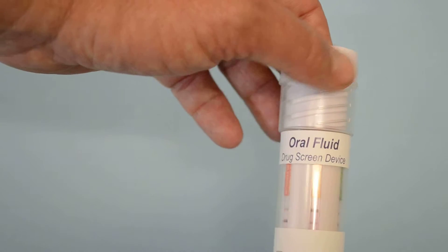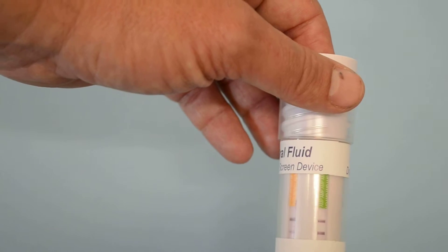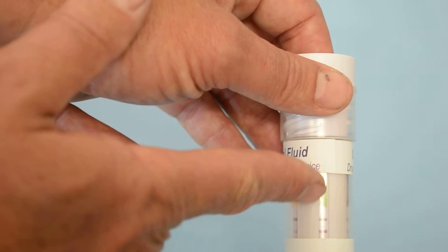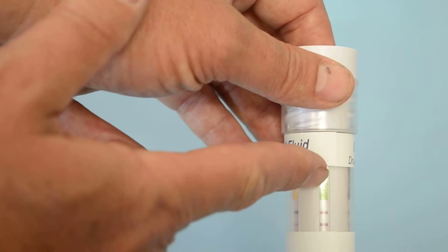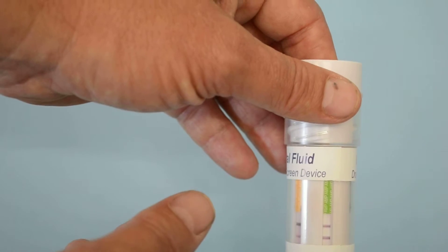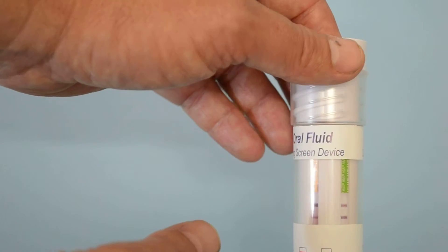An invalid test result would be any of these membranes which does not demonstrate a control line. The control line is the line that forms nearest the coding end at the highest level, and the test line is the line that forms nearest the saliva end where the sample has been squeezed out of that swab.